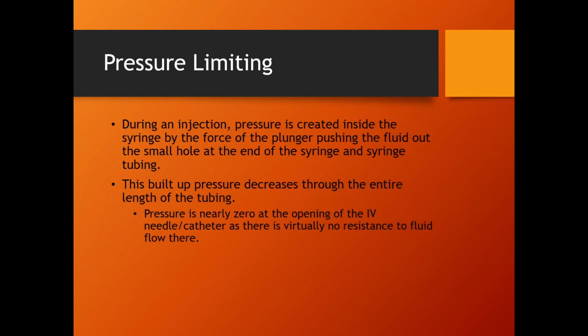Unless they're using one of those IV needles that's actually more plastic than metal, they can't always go with that high of a pressure limit. If it's a metal needle, metal IV needles are rated at 400 PSI. So if they're using a metal needle, for CT and MR injectors, just set the pressure limit as high as you can make it, 300, 325.